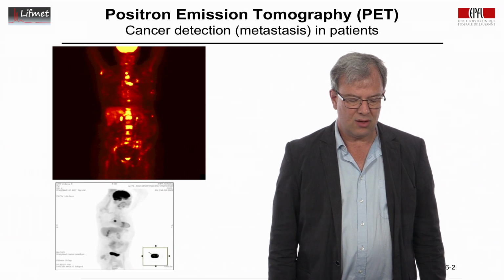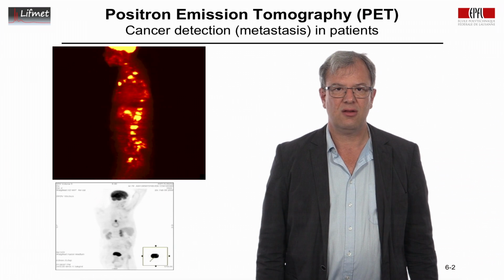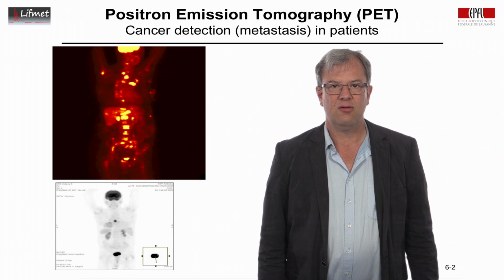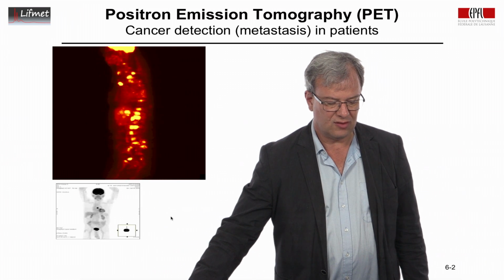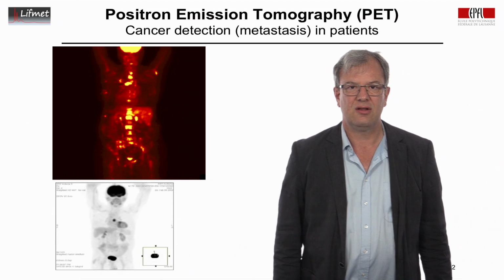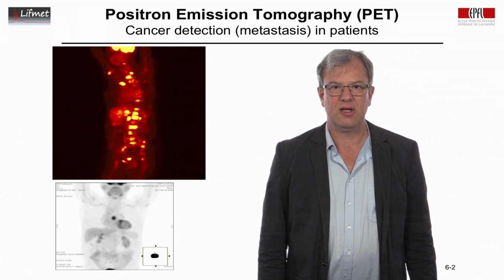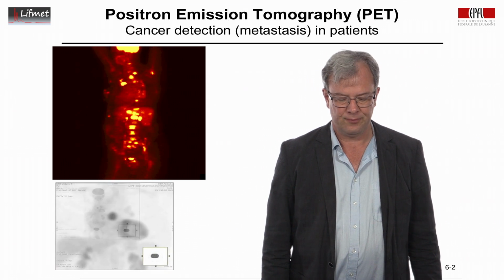Here in this video you see also, this is a deoxyglucose uptake scan. You'll see on the top the brain, which has a lot of uptake, and the bottom you can see the bladder. We can see in the middle the heart, and you can see just above the heart this little spot there. That spot shouldn't be there. That is a metastasis in this poor patient.